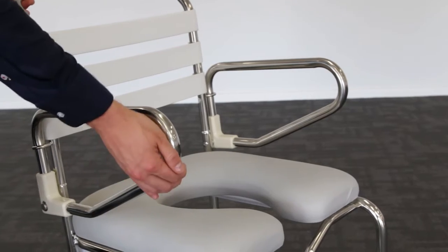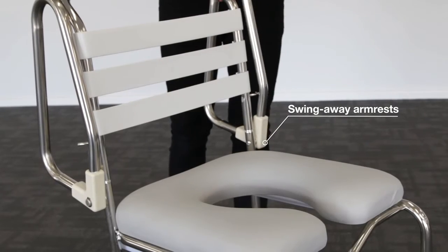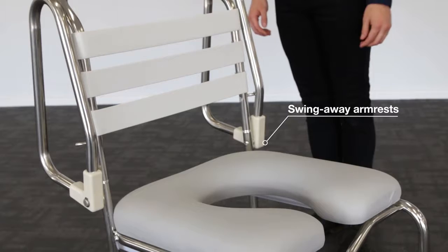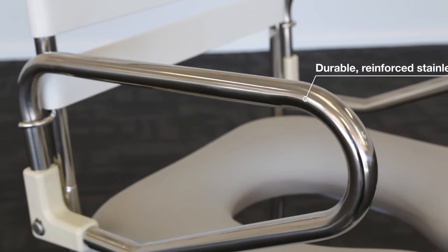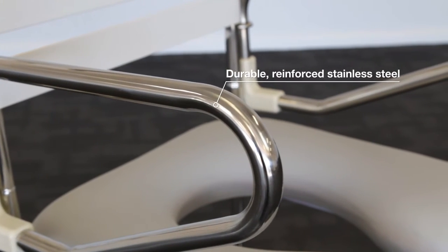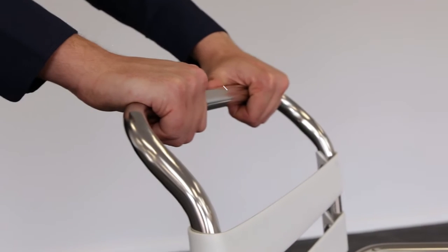The commode comes with a 200 kilogram weight capacity. Both armrests swing upwards allowing for easy side access to the commode. The durable frame is made from reinforced stainless steel, and moving the commode is easy with the convenient push bar.